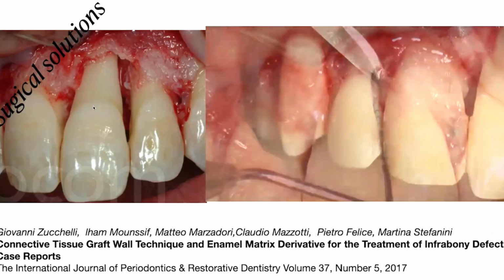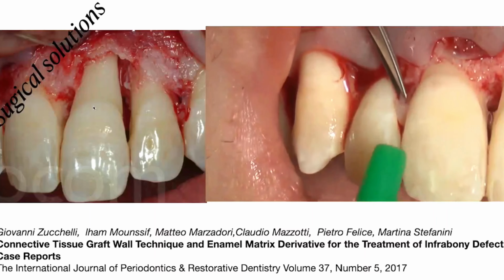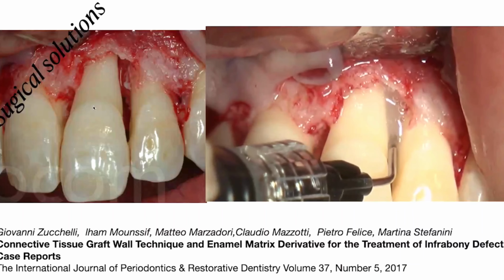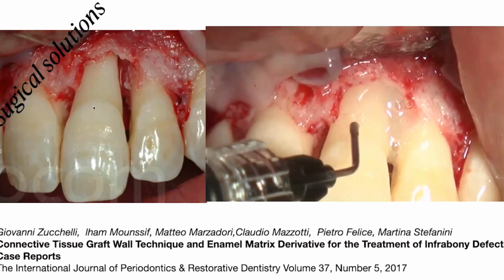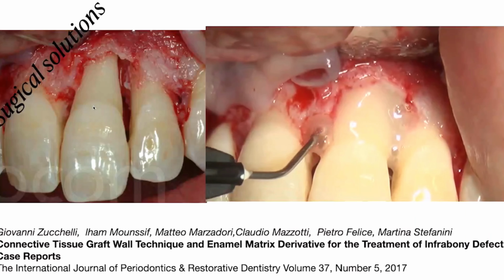Despite this defect in terms of regenerative potential being absolutely not favorable, the healing of the bony defect depends on how much we can, let's say, cover and isolate the defect from the oral cavity, and it does not depend almost anymore on the number of bony walls like it was thought in the past.